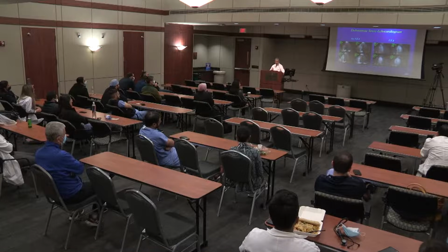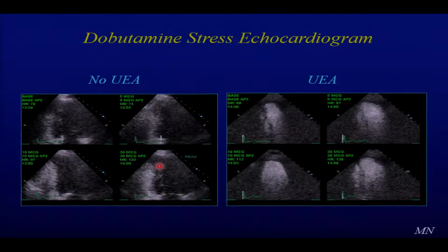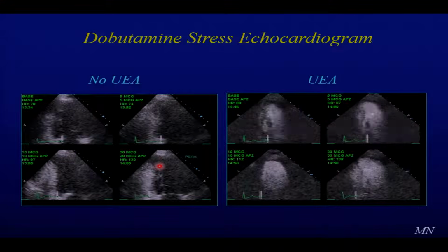Okay, this is the same case who had contrast. So this is the same patient, another dobutamine with contrast. How do you interpret it? So number one, you can interpret it this time. How do you interpret it?